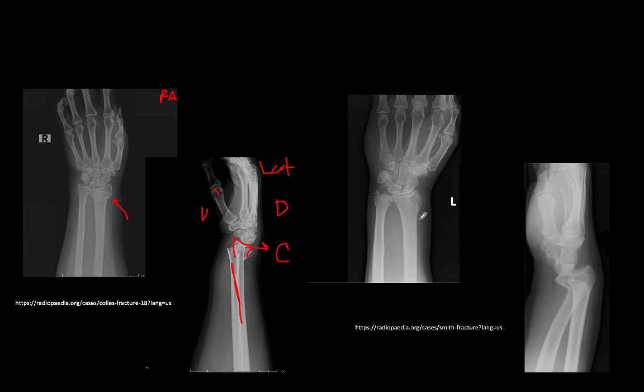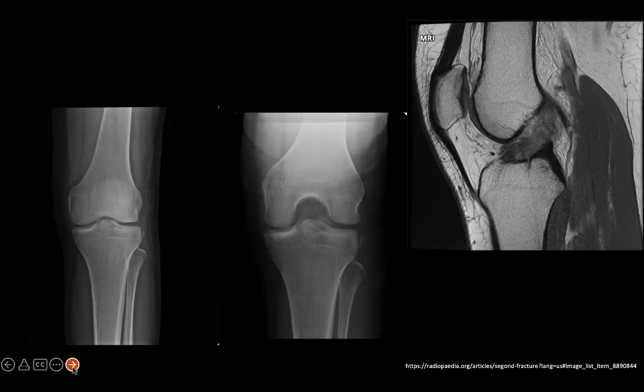Now, in the image off to the right, the patient has a distal radial fracture. It's a little hard to see here, but notice on the lateral view that there's ventral angulation of the radial fragment. This is a Smith's, also known as reverse Colles. We know this is ventral because of the thumb, the first metacarpal, sitting ahead of the rest. This is the dorsum of the hand, so ventral malposition of the radial fragment: Smith.